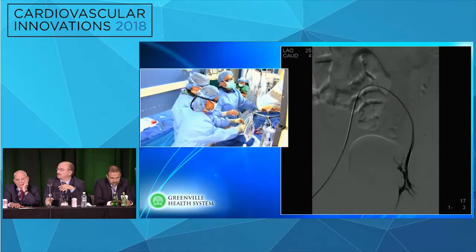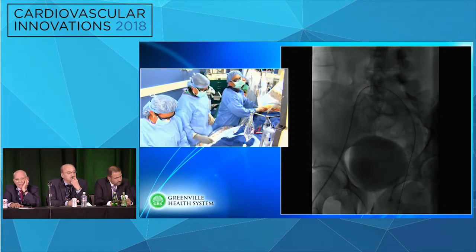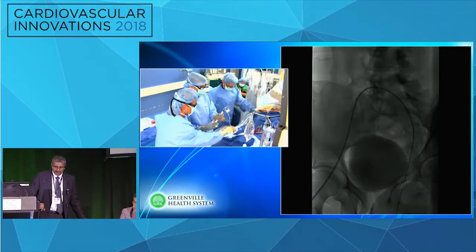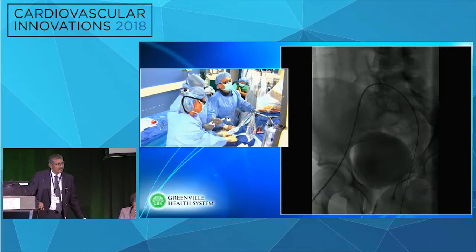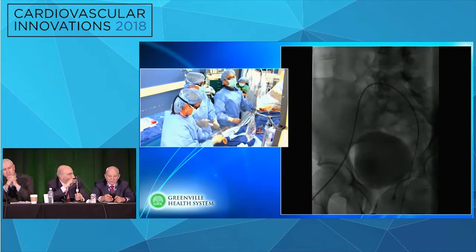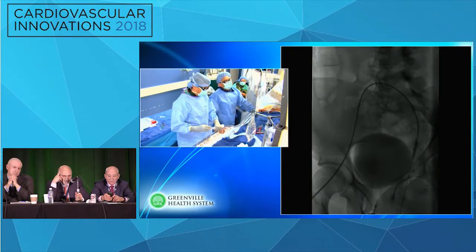So how many of you will actually do that? Measure the contralateral vein and size it, or just pick an empiric 16 millimeter? Or empiric, actually, yeah. I get worried with the chronically occluded veins that they're really not the same size, and you can't make them the same size. So I think the strategy of progressive dilatation is really a smart and safer one. This is a little different, but perfection's the enemy of good here.